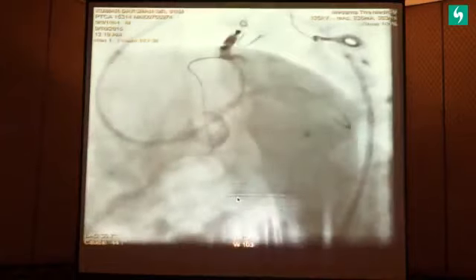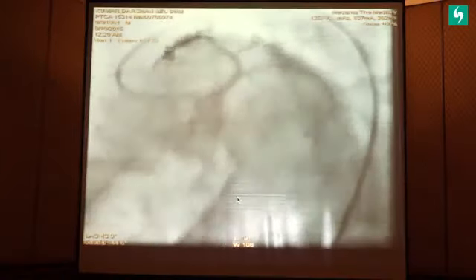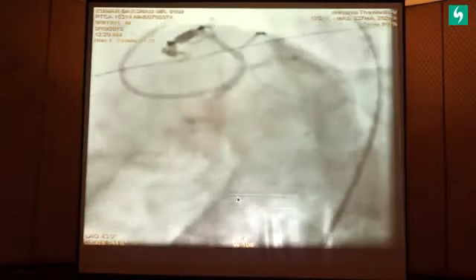Now it was a little bit easier because I had a track with a stent closing off this dissection, and I was able to cross this LAD, put in a balloon and put in another stent in the LAD left main, and did a final kissing. This is after the final kiss, and you see the left main lesion is gone. This ostial LAD has been very well stented.